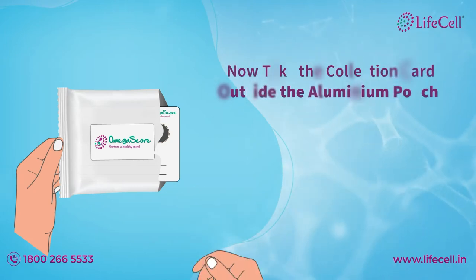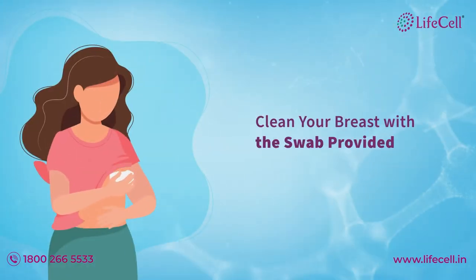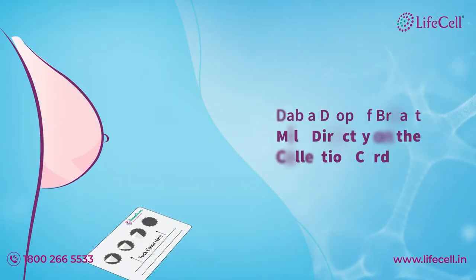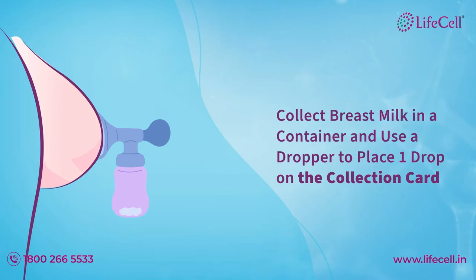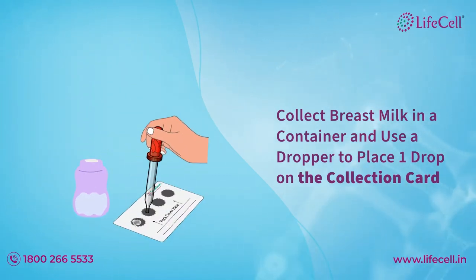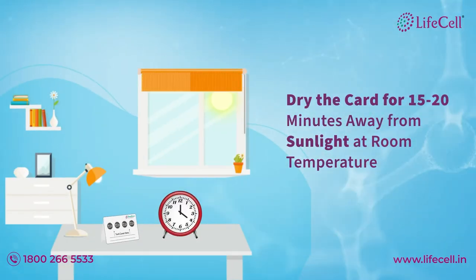Take the collection card outside the aluminum pouch. Clean your breast with the swab provided. Dab a drop of breast milk directly onto the collection card, or collect breast milk in a container and use a dropper to place one drop of breast milk on the collection card. Dry the card for 15 to 20 minutes away from sunlight at room temperature.